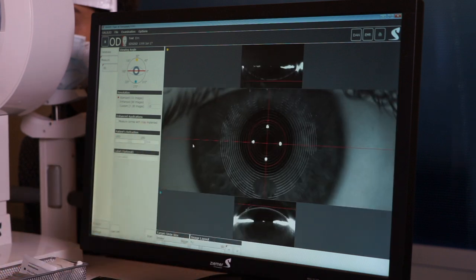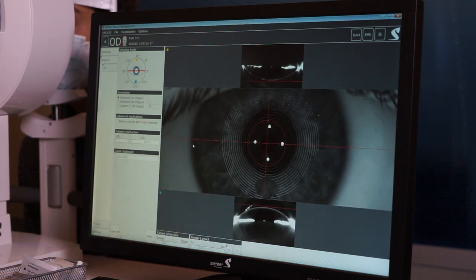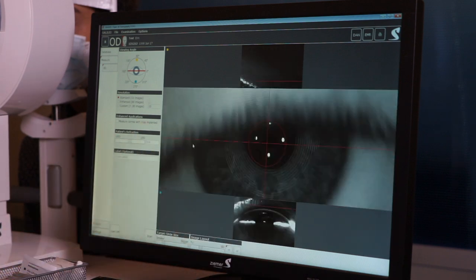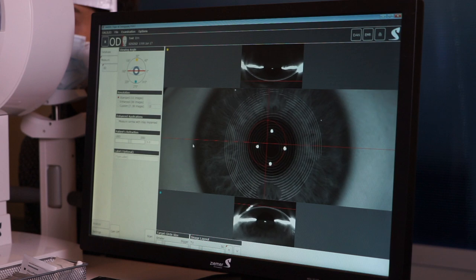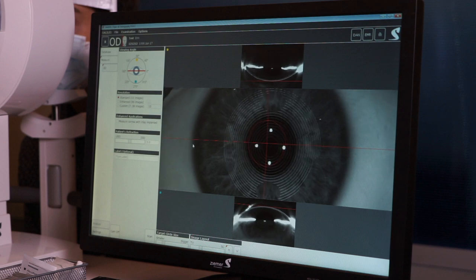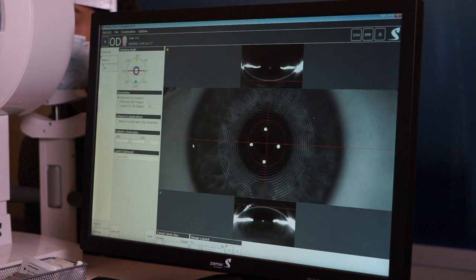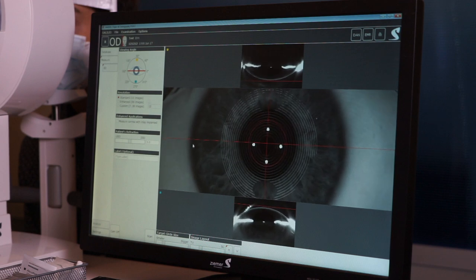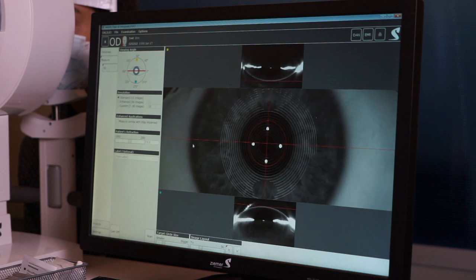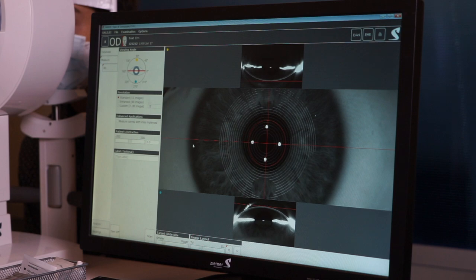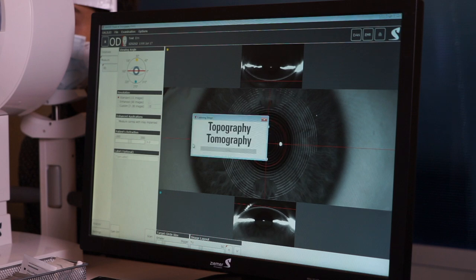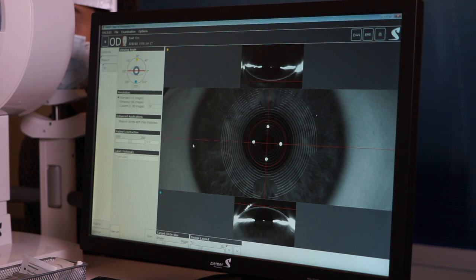Once they're aligned, have them blink twice, then eyes wide open as big as they can. Make sure you're lined up and hold still for a couple seconds, then you can have the patient sit back.